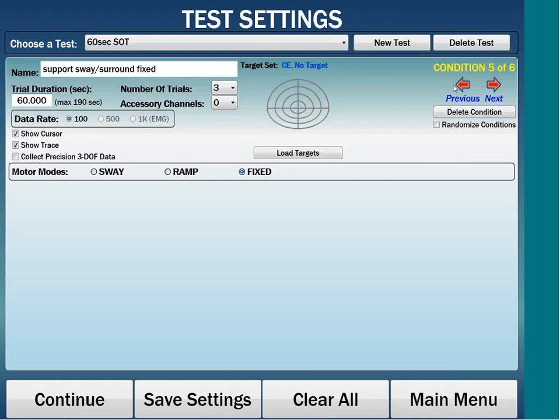Okay, thank you, Christina. We won't go through all the trials. There's 18 of them. After the trial is done, the software prompts me to ask if I want to save the data, and I can certainly review the trace of my patient and choose to not save the data, which would mean the software would not advance further and would allow me to repeat the trial.